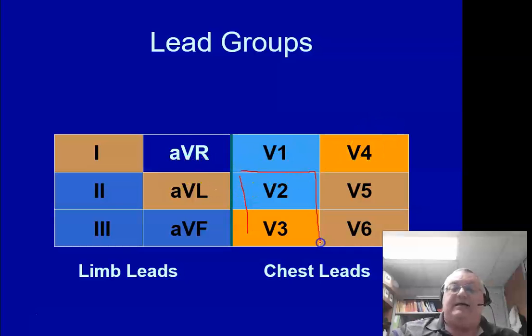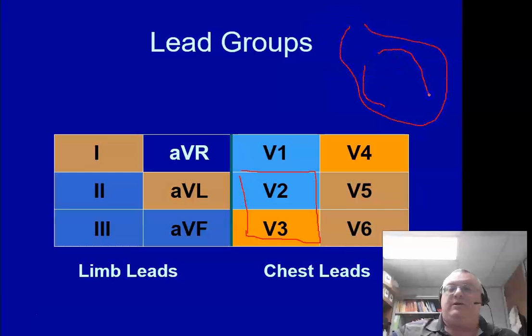Remember that these guys can actually go together as well, okay? And if you stop and think about it, remember that you got those two arteries that come off, right? You got your left and your right coronary artery, and then the circumflex goes around. Guys, this artery here feeds that same area of the heart, right? That's the V2 area, and over here is kind of the V3 area, and over here is kind of the V4 area. And there are little anastomoses that come off.